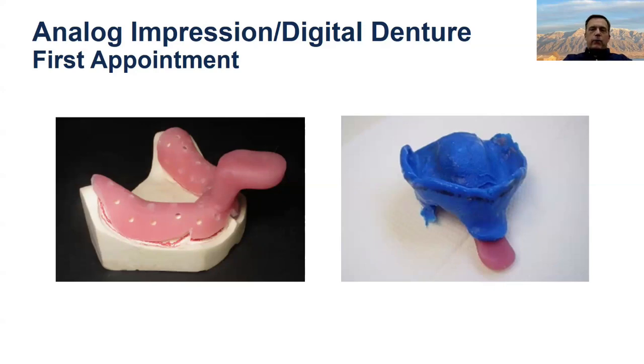You can take preliminary impressions, do a custom tray if you want, or directly take your master impression. You'll need to use your normal border molding. Your digital denture will fit accurately, like we talked about, to whatever data you give. So the variability will be the accuracy of the master impression. Investing a little extra time, making sure you get that awesome border molded impression, will result in you getting the most benefit from the advances in fit of a digital denture.